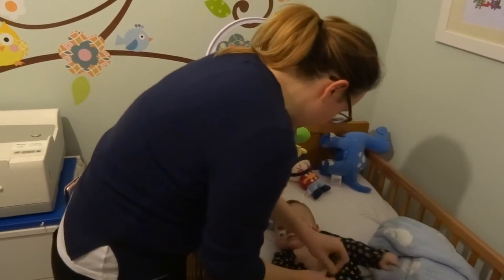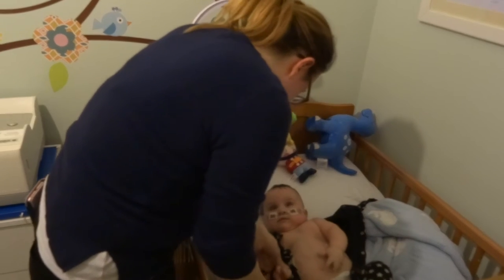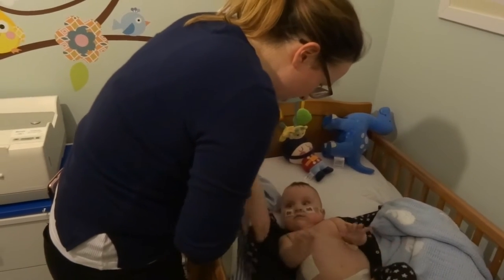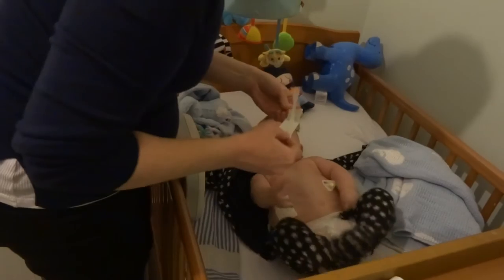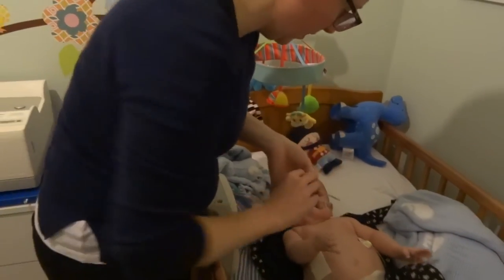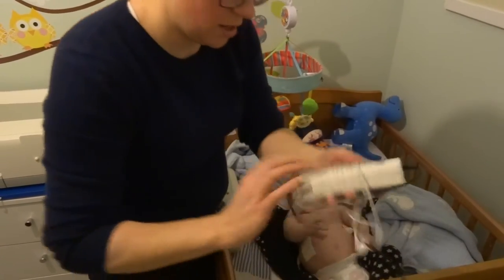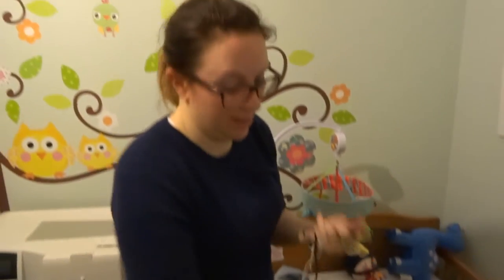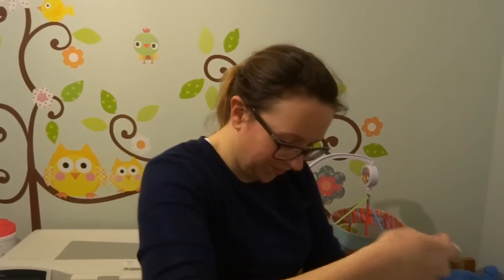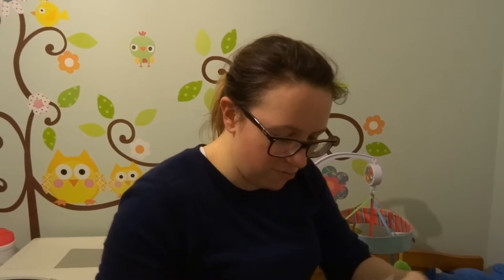So let's take Ethan's temperature now. Here is little Ethan — as you can see, this is his dialysis catheter, and that's his dressing which also needs changing today. I'm going to pop the thermometer under his arm; that stays there for three minutes. While we're waiting, I'll take his blood pressure. The cuff comes with headphones just to cut out the background noise, so you can really hear his heart rate.